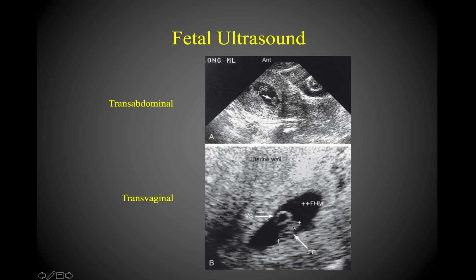So then when you look at it via transvaginal ultrasound, you can now even appreciate the yolk sac, which is this little cavity that you see right there. And then this is the crown rump length right here. And then the little plus sign that's been placed over here just indicates the fact that the ultrasound technician observed fetal heart motion. So at this point, the fetus does have a heartbeat. Remember that happens very early on in the developmental process, and so we're able to pick up on that at about 6 to 7 weeks, usually on ultrasound.